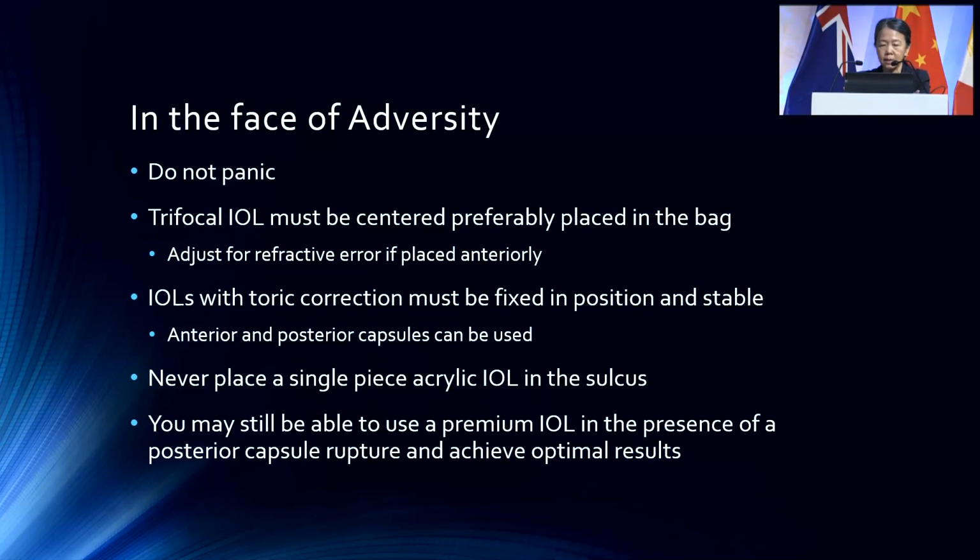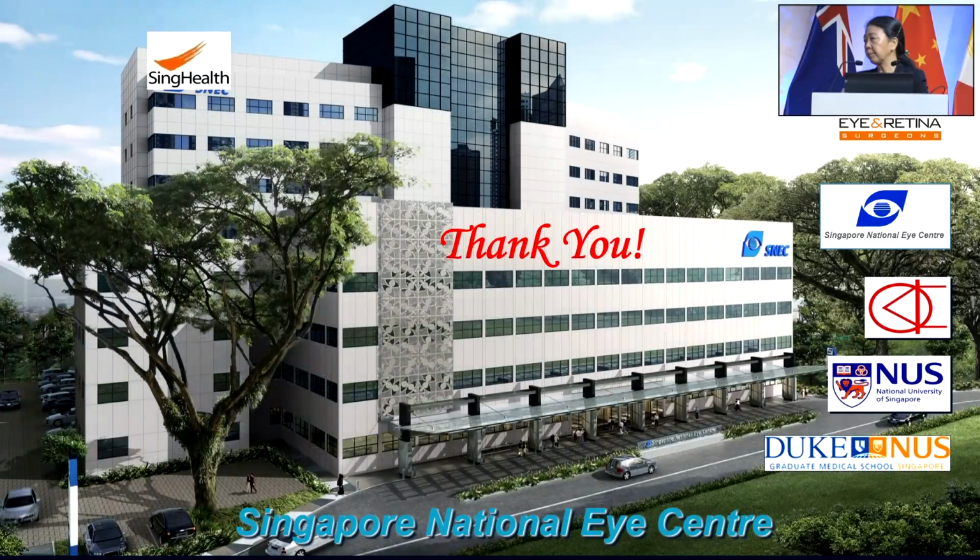But never place a single piece acrylic lens in the sulcus if it's not locked into place. All right? You may be able to use a premium IOL in the presence of a posterior capsule rupture and achieve optimal results. Thank you very much.